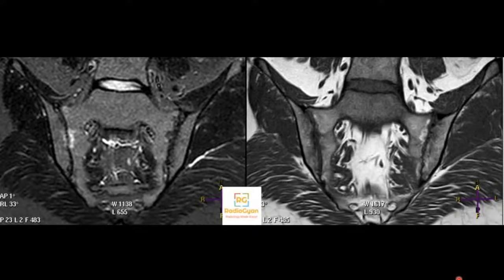What if I ask you, what if a patient has this kind of imaging picture and he has associated bowel thickening? What would that be? Perfect. Enteropathic arthritis, or inflammatory bowel disease associated arthritis. So what's important is that whenever you see either of these findings, always document the corresponding finding. So for example, if you see bilateral sacroiliitis, document that there is no bowel thickening. And if you see bowel thickening typical for Crohn's or ulcerative colitis, make sure that you look at the sacroiliac joints on CT and talk about them, even if they are normal, but make a specific comment about the sacroiliac joints.